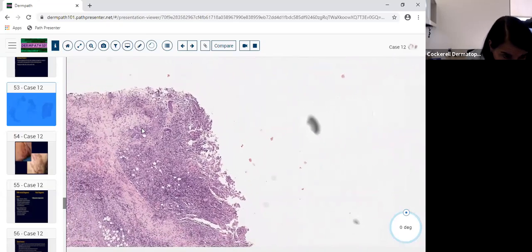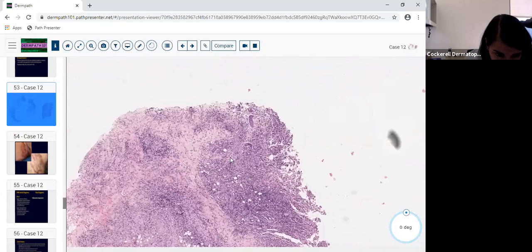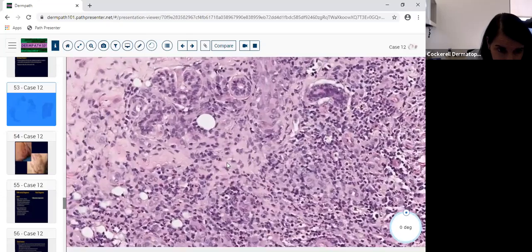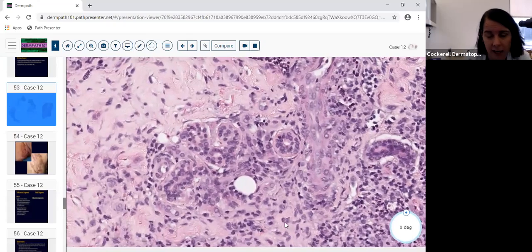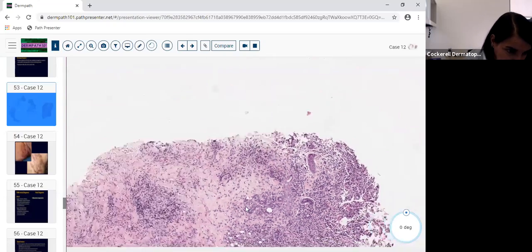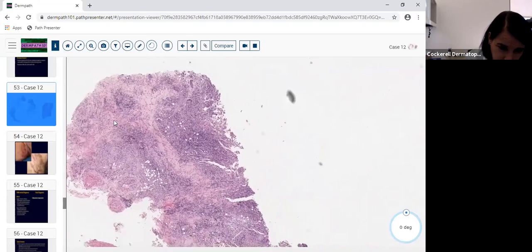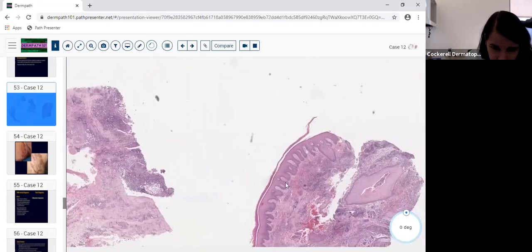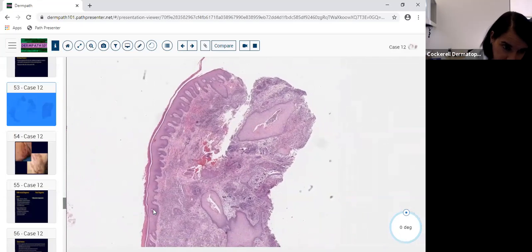Over here, there's some more eccrine glands. I don't know if you can see my arrow again, but I'll put it in the center. So I think you can appreciate those are probably eccrine. I did look around for some apocrine glands just to try to figure out where this is coming from, what site in the body. I like to try to figure that out. Don't confuse this with thick skin. It can't be because you have follicles.